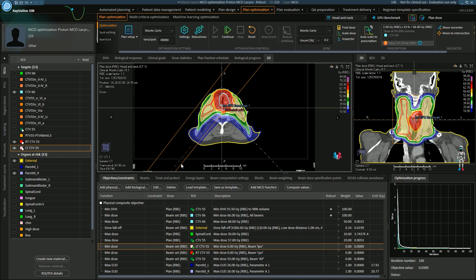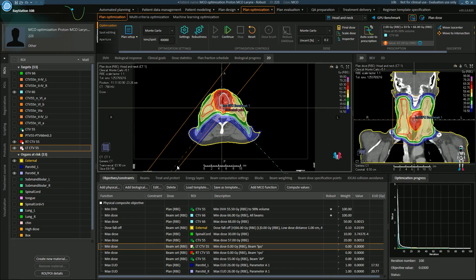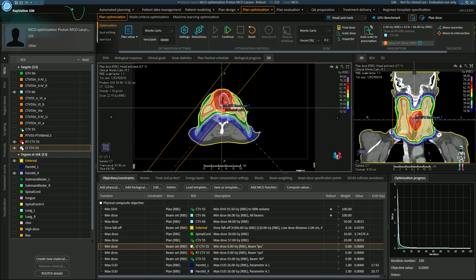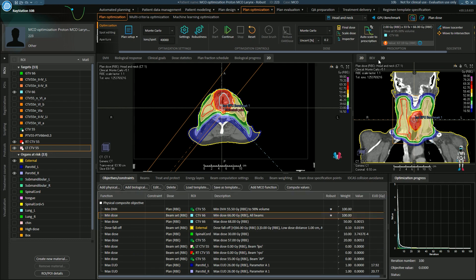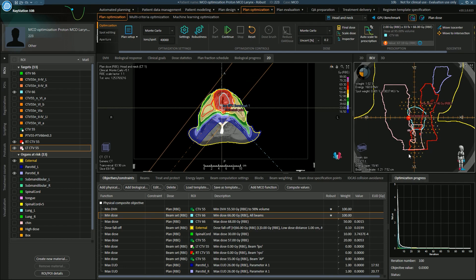This patient is treated with three beams. I can ask the system to use the left post oblique to only treat the left-sided target and the central high-dose PTV. It will then avoid having dose travel through this healthy tissue, thus sparing it further. This is particularly important because it can help me limit the dose to critical structures like the spinal cord. Let's have a quick look at the spots in the beams eye view. As we scroll through, we can see this is what is happening. You will notice there are some spots outside of these targets.